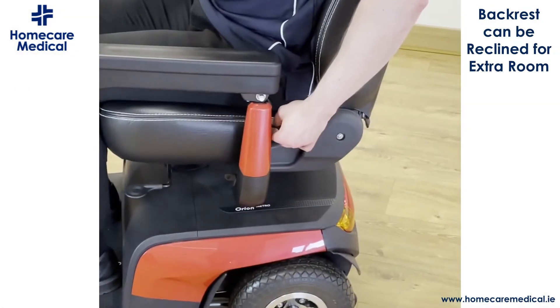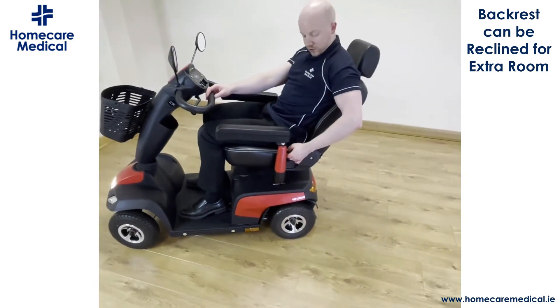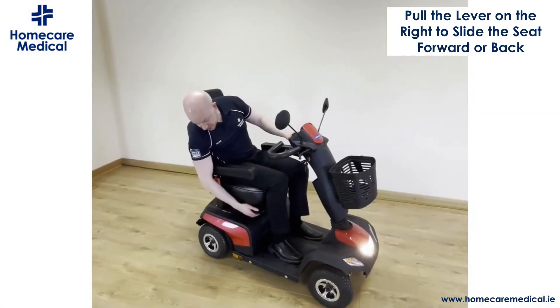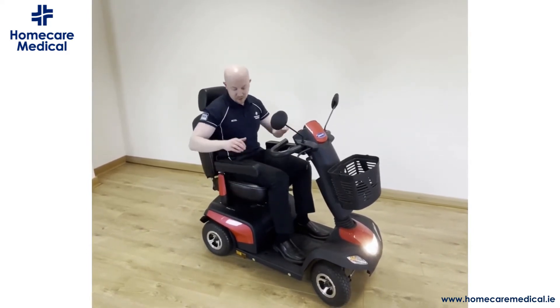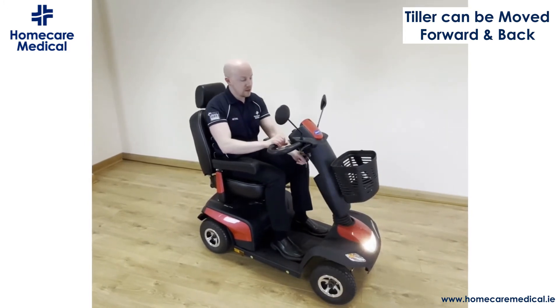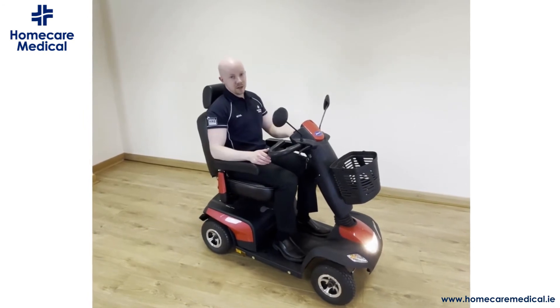You have another lever here which allows you to adjust the angle of the backrest, so if you want a little bit of extra room you just release and set it in whatever position you want. This lever then allows you to move the seat forward and back. Not only can you adjust where the seat sits, you can also move the tiller forward and back as well, giving you a lot of control over your seating position.